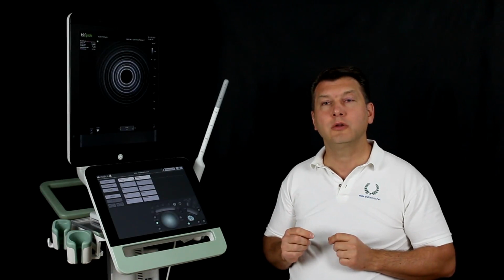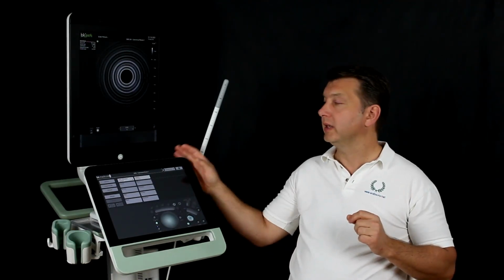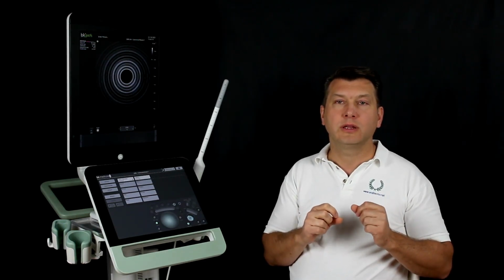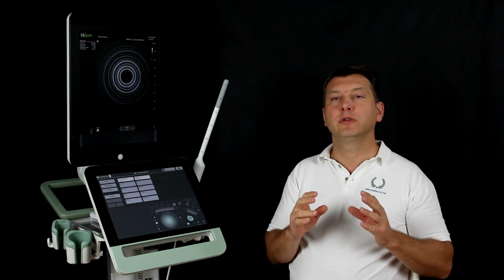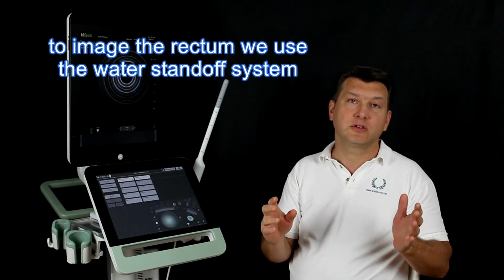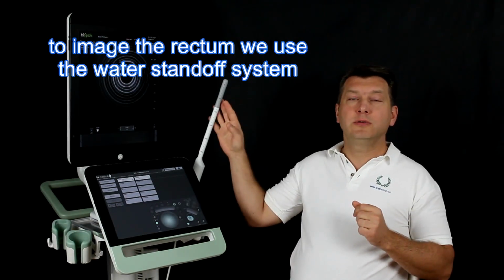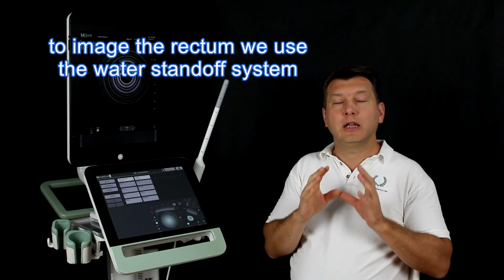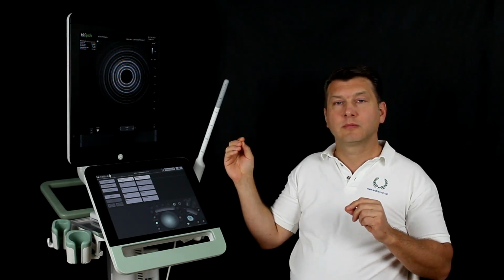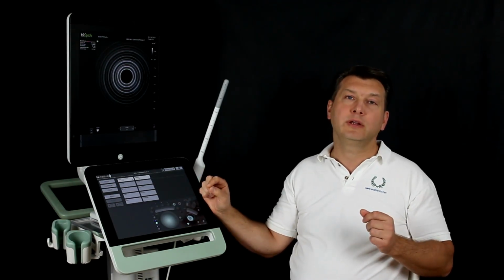In this video I show you how to perform rectal 3D endosonography with the Specto from BK Medical. We should note that the settings are basically similar to those of anal carcinoma sonography. A few parameters, however, are changed. Furthermore, for better coupling, balloon systems are used, which enable unopposed sound transmission from the probe to the tissue. The use of these balloon systems is explained in our separate videos.